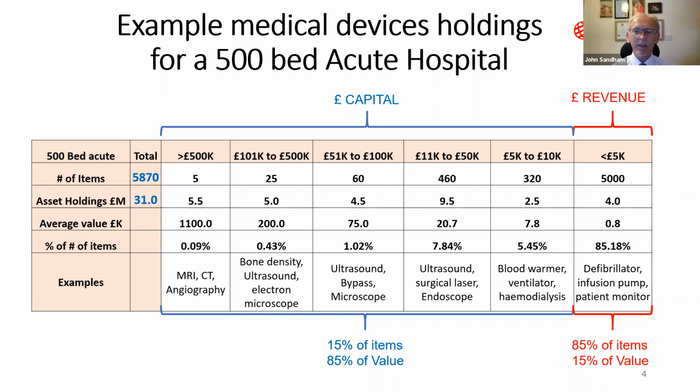When buying any medical technology, Health Level 7 or HL7 data transfer capabilities must be considered as essential if the ambition of your organisation is to ensure that device data can be transferred automatically and immediately into the electronic patient records, thereby improving data integrity.